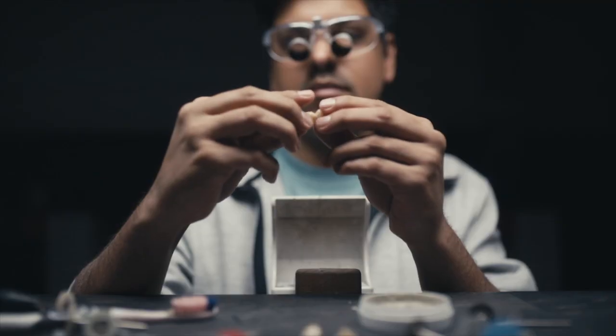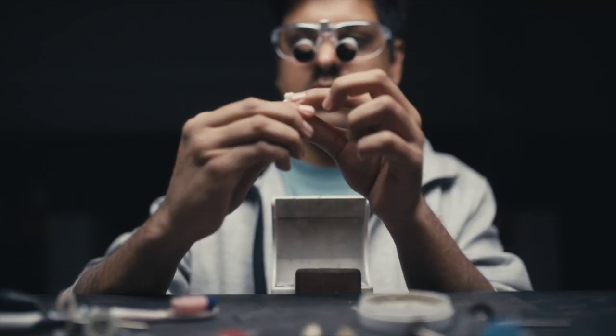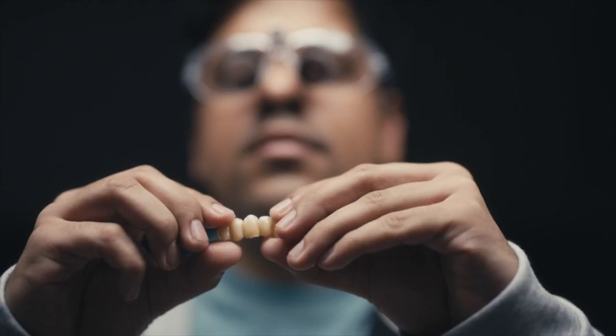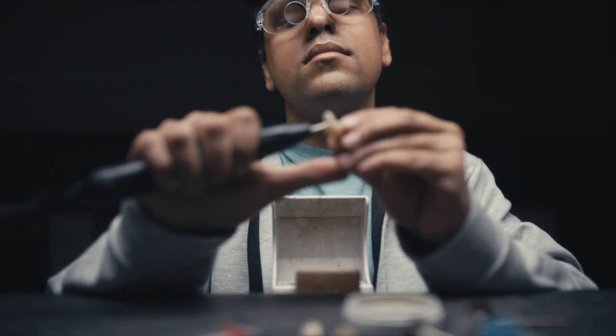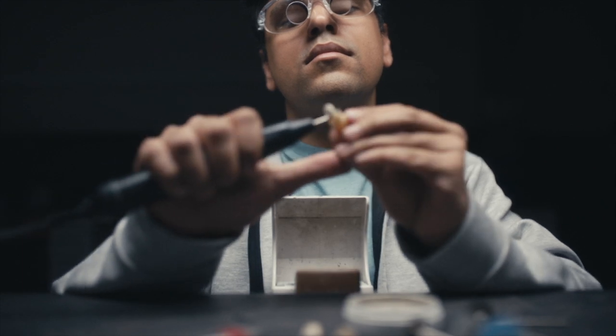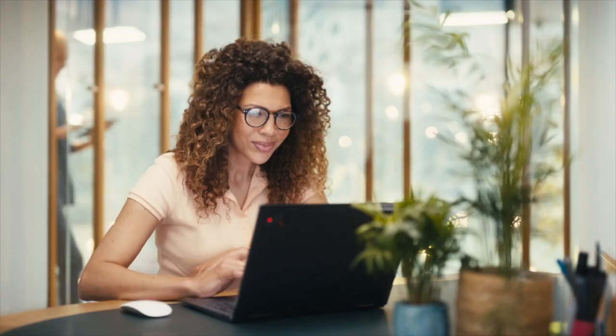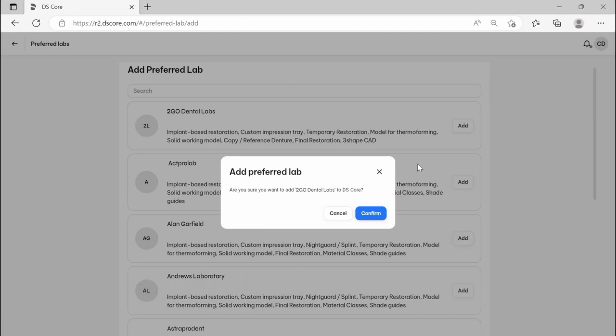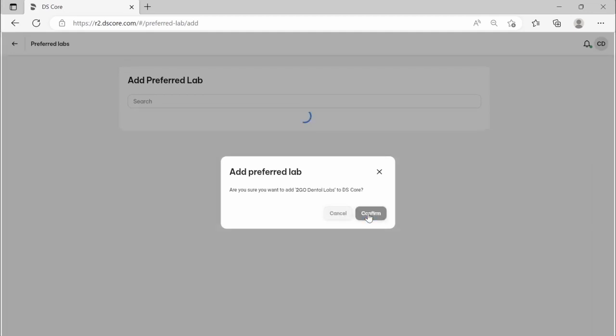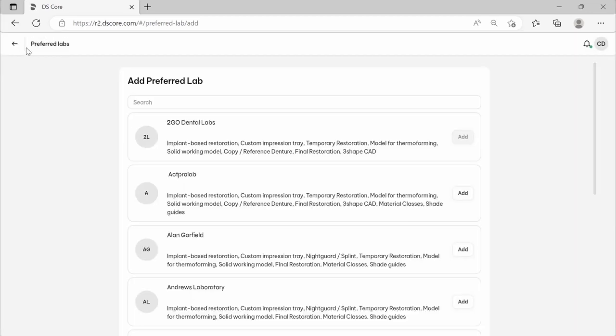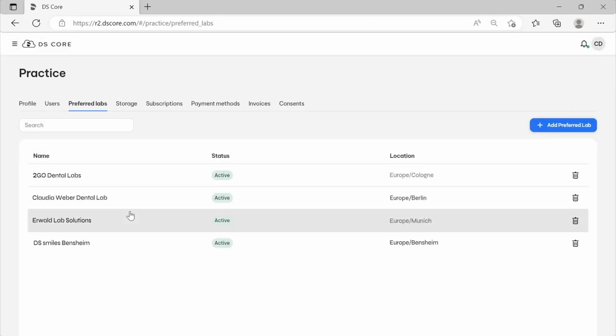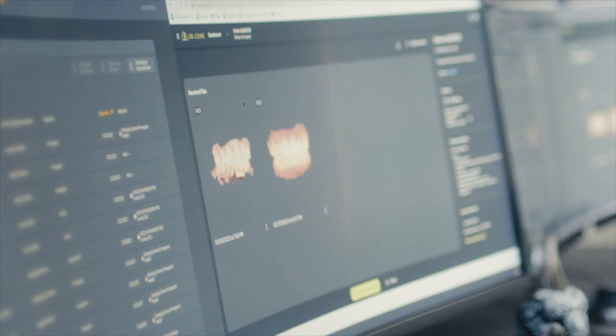Our goal is not only to help you make your existing collaborations more efficient. We designed DS-Core to help you grow your business by making your services visible to all dentists on the platform.